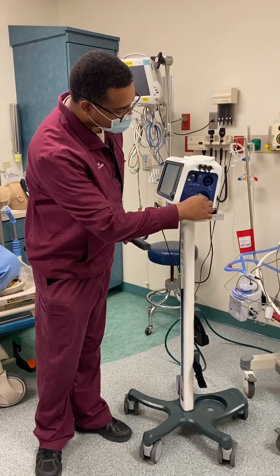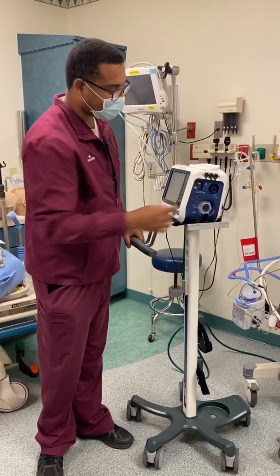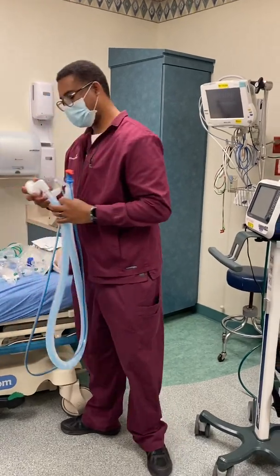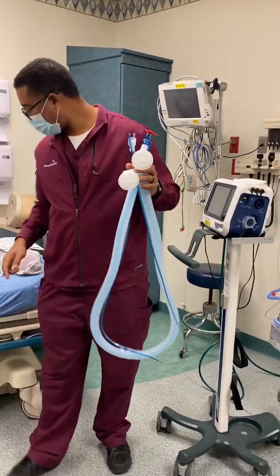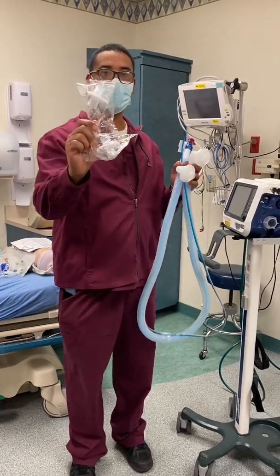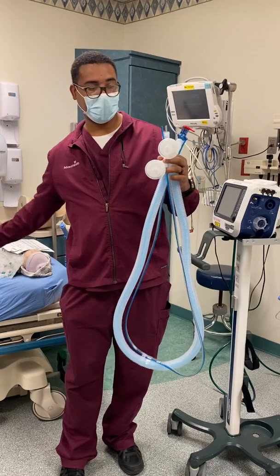Set it down and turn. There are also two filters that you need to have to set it up. It'll be in a package like that and it goes on there.